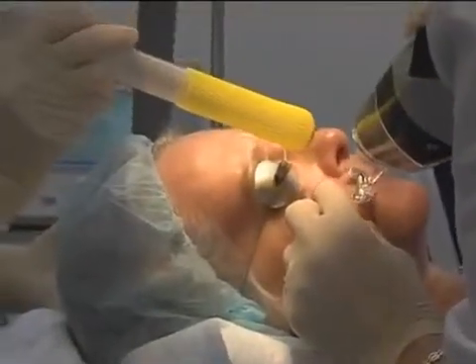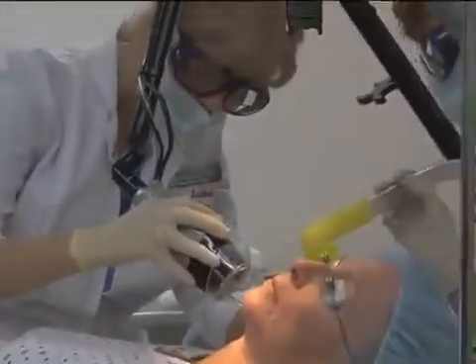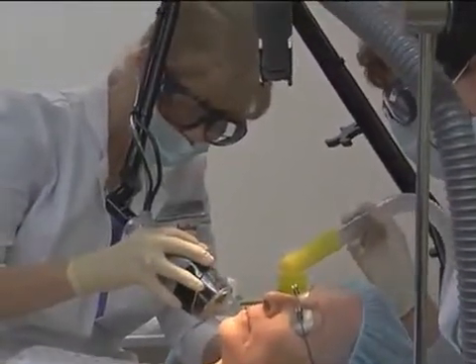It's good for hyperchromias, it's good for fine lines, it's good for thin skin where you hope to thicken the underlying collagen because the fractionated CO2 laser goes into the dermis well and treats the dermis. We've had a good time with this laser because it is user-friendly, and this I think is a very important point. It's so easy that you can train your nurse technician to do these treatments while you're doing surgery or other things.